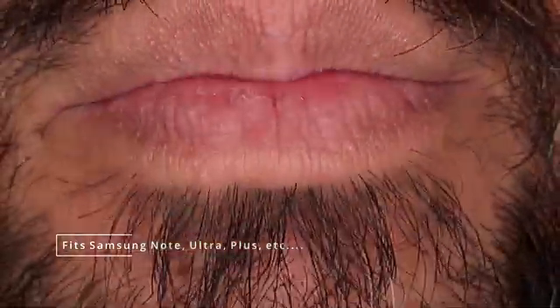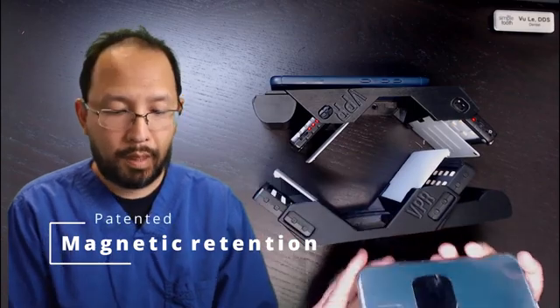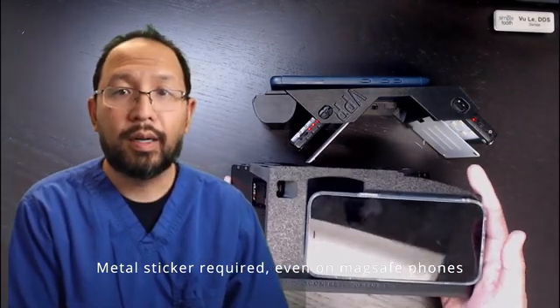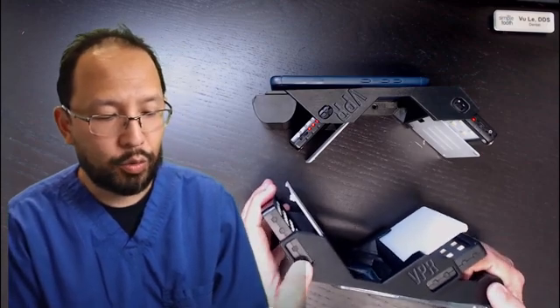Both models continue to be compatible with your large Apple or Samsung phones, so no worries about phone compatibility. Either way, they both continue to use the magnetic snap system — this is an iPhone 12 — and we still use stickers on it.